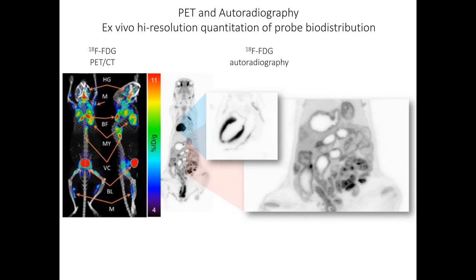So the color scale and the color patterns that you see on that image is actually coming from the FDG itself and its biodistribution. What is interesting is that because it's an analog of glucose, when you look at that image, the PET image, you're actually looking at which tissues are highly glycolytic, which tissues are actually metabolizing that glucose or that glucose analog with high avidity.